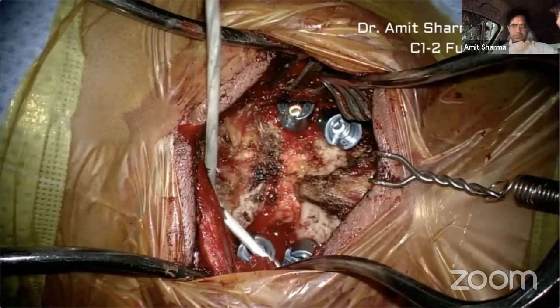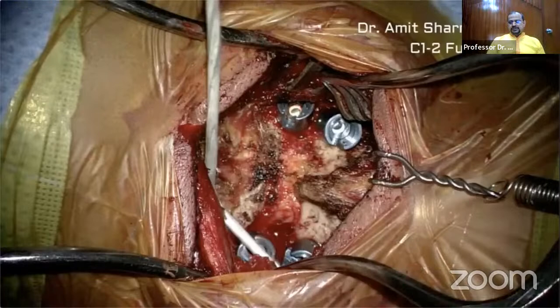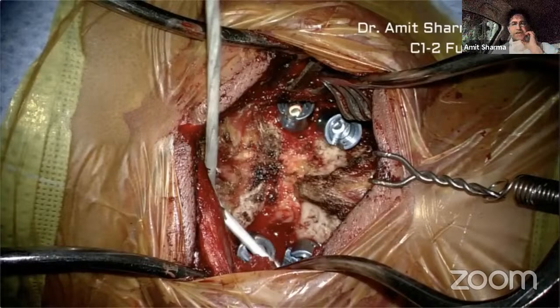For C1 screw, lateral mass screw, have you followed the Goel technique, like the posterior arch of the C1 arch overhang over the lateral mass, you remove that part of bone and then you put the screws? No, I haven't done that.